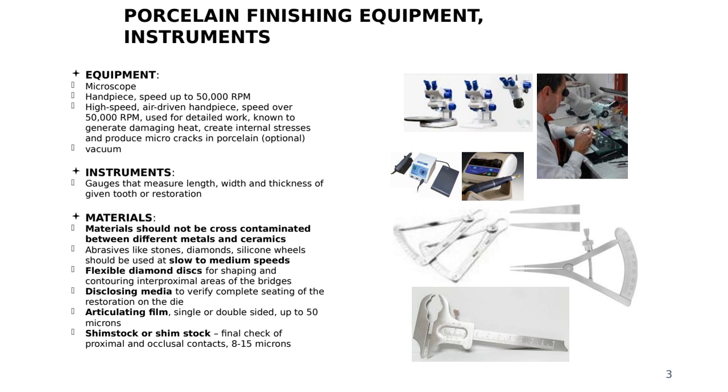There are some porcelains that if we don't apply enough dentin, it looks dead. The value is really increasing. So it looks grayish, it looks opaque, it looks like a dead tooth. And it doesn't have that translucency like an actual tooth. So maintaining that ratio of porcelains in build-up is very important.